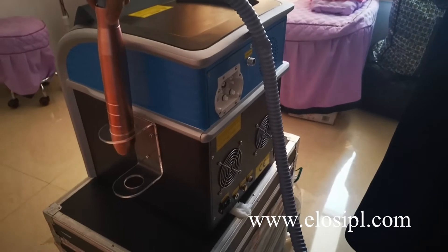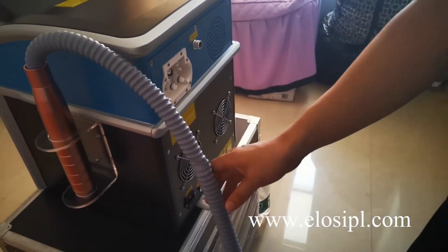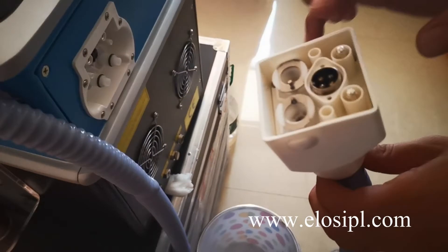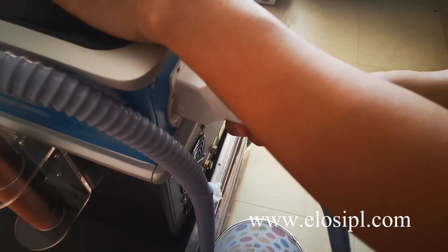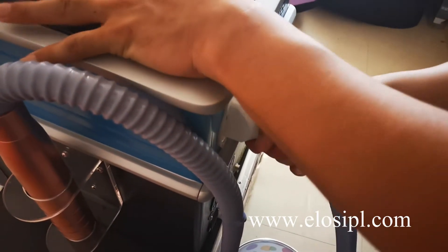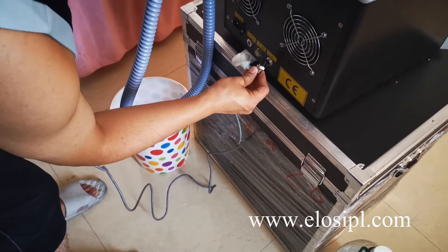Connect the laser handle to the machine. Connect the foot pedal to the machine.